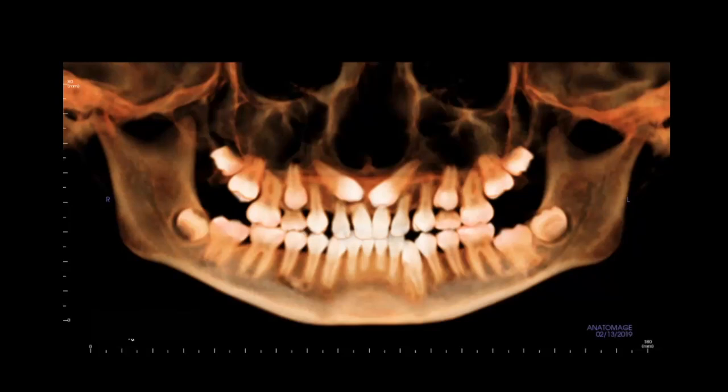All right, so if we use TADs, what might we do with TADs? Okay, you could lower TADs. If you put some TADs on the lower, I guess you could run an elastic directly to the TAD up there. That would be one way of doing that without extruding the lower teeth. But I don't know how much of a difference in anchorage it would be. It might help with your deep bite correction, right? Because you're not taxing those anterior teeth in the front. Where else could you put a TAD?